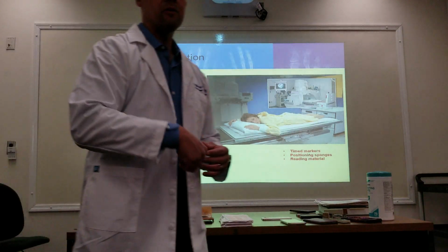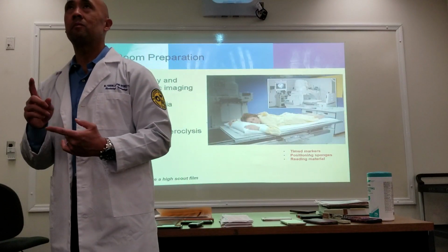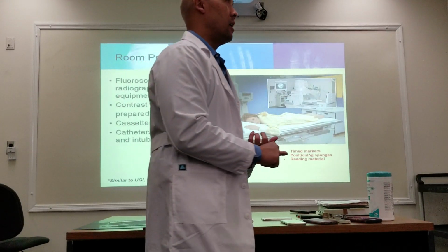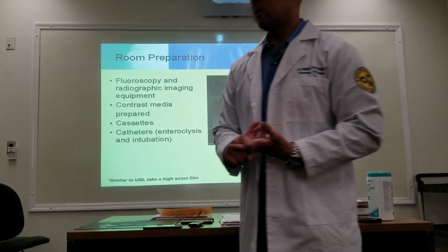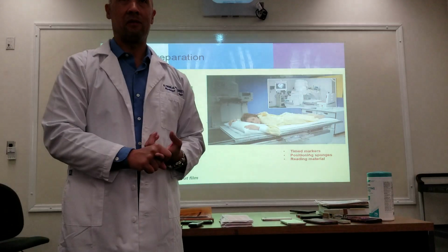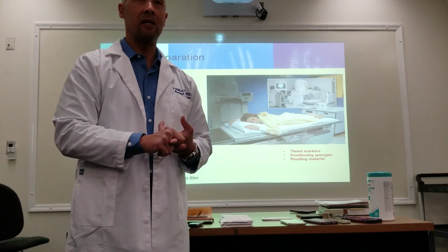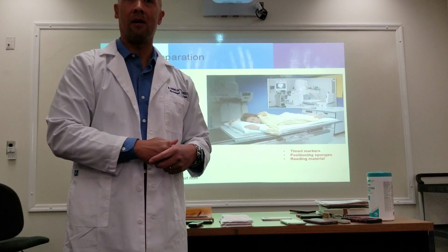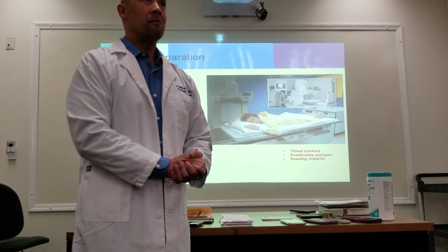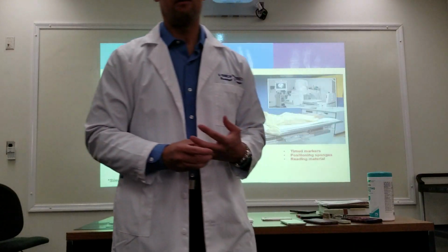So now you call the doctor in and then you begin the procedure. I was talking to Mr. Benoit when I saw him a couple of days ago, and he said that in his facility they never did overheads after the fluoro part of it. The doctor only did the fluoroscopic part, and they were done. But he did say he ended up working somewhere else where they did fluoro overheads.